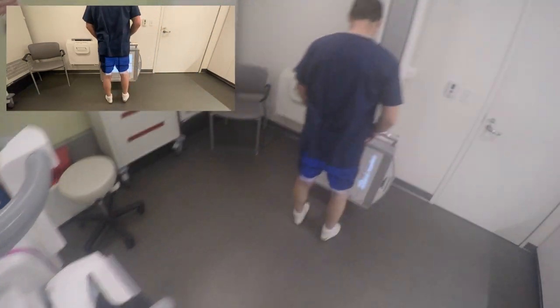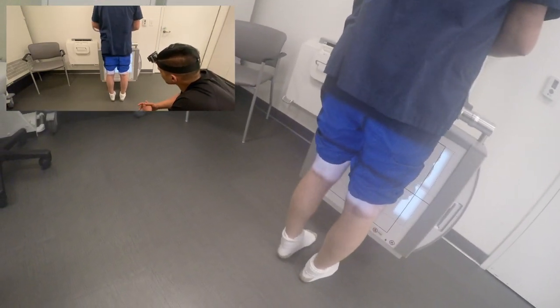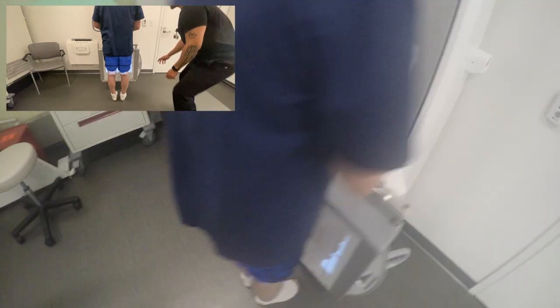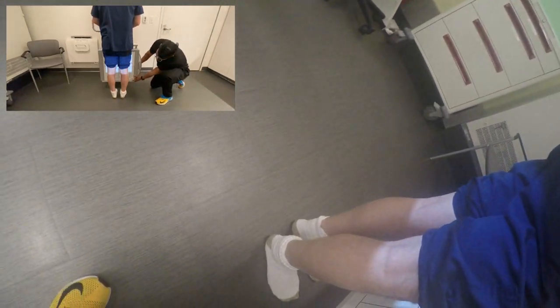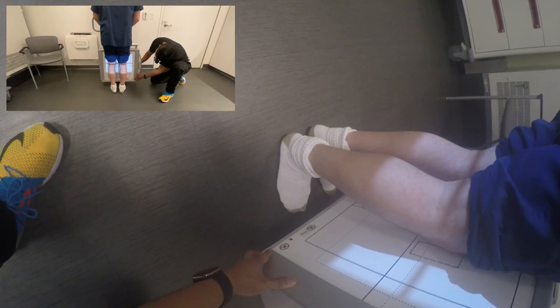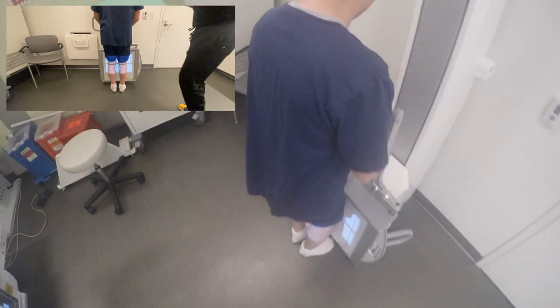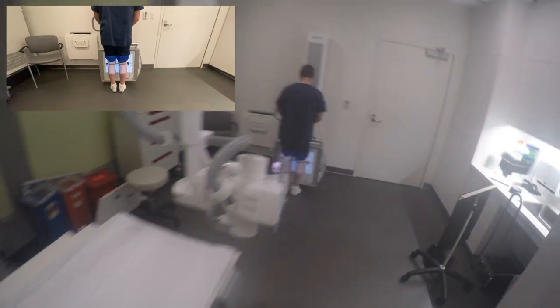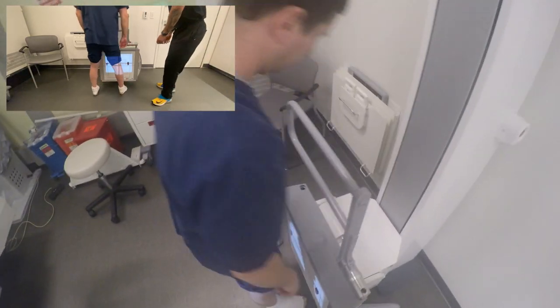Go ahead and stand right over there, facing the board. Get your legs together. Your knees are going to slide over to your right a little bit — about right there, good. Let me get everything lined up to you real quick. Go ahead and get a little bit closer, there you go, and then bend your knees on that board. Relax. We'll have you step to the side real quick to get everything lined up for the next image.